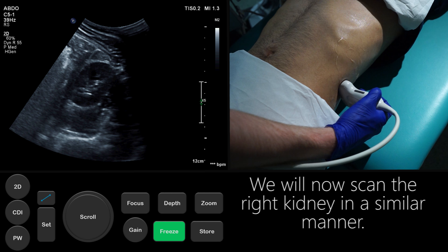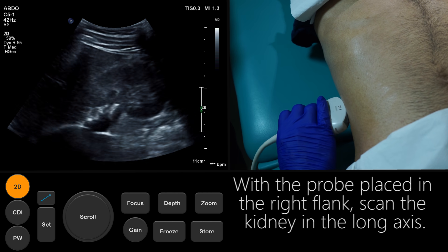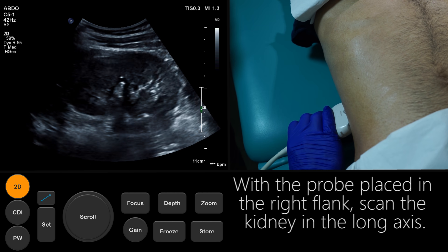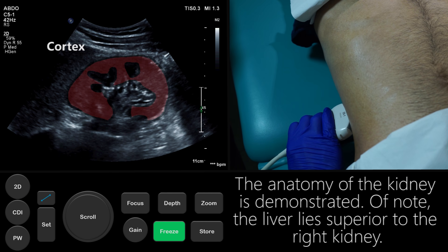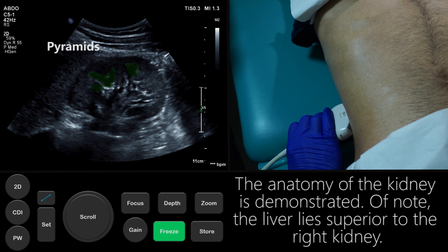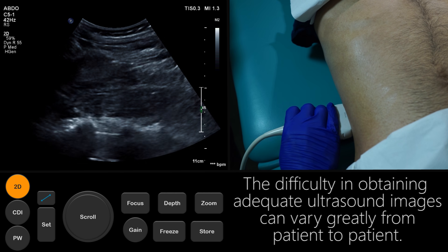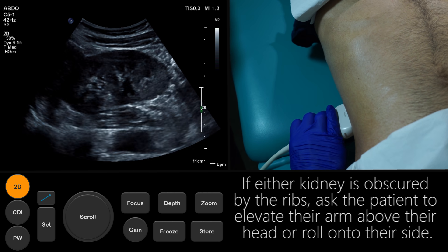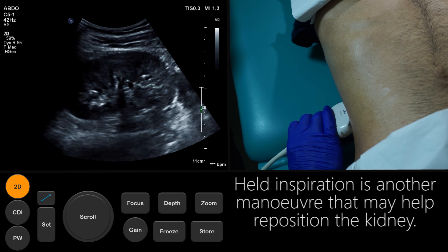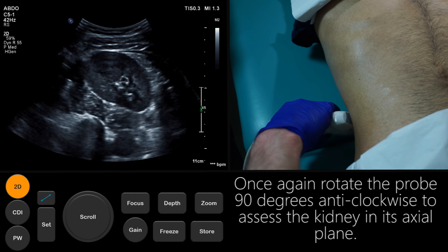We will now scan the right kidney in a similar manner. With the probe placed in the right flank, scan the kidney in the long axis. The anatomy of the kidney is demonstrated. Of note, the liver lies superior to the right kidney. The difficulty in obtaining adequate ultrasound images can vary greatly from patient to patient. If either kidney is obscured by the ribs, ask the patient to elevate their arm above their head or roll onto their side. Held inspiration is another maneuver that may help reposition the kidney. Once again, rotate the probe 90 degrees anti-clockwise to assess the kidney in its axial plane.